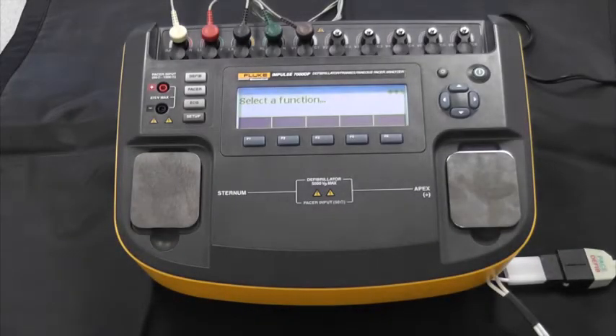I want to talk about the Impulse 7000 defibrillator and pacemaker analyzer from Fluke Biomedical. This is the Impulse 7000 — you can see we have it all set up, with some ECG leads connected to it. This unit is designed for testing any defibrillator, including AEDs, and the transcutaneous temporary pacemakers that are integrated into defibrillators.